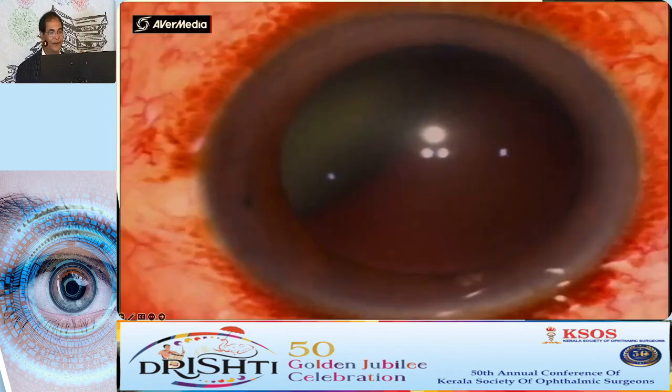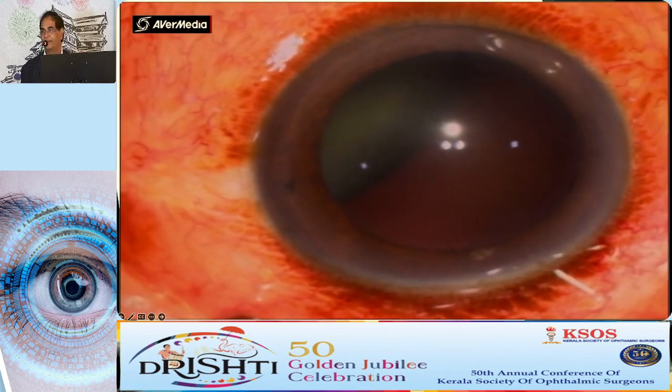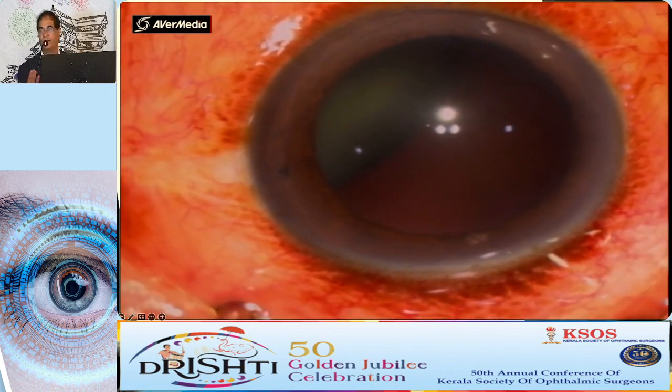Now this is another case in which the lens is dangling. It was a challenge for me from my VR surgeon: Sir, I am there, if you can, put the lens in the bag. I told him, if I am taking the case, I will do that. So what are the challenges you will have? First is the vitreous; it is full of vitreous and the lens is dangling. First thing is to bring the lens up.